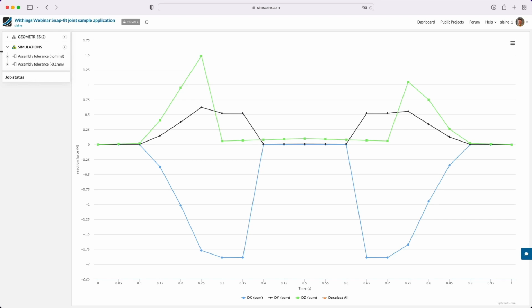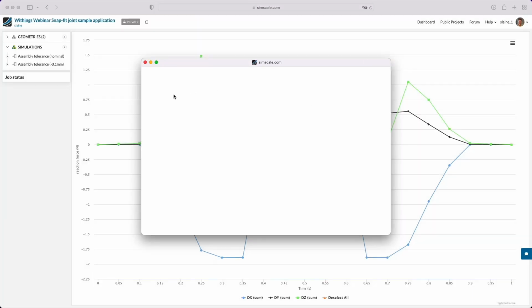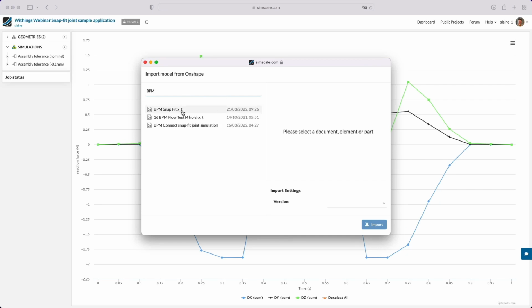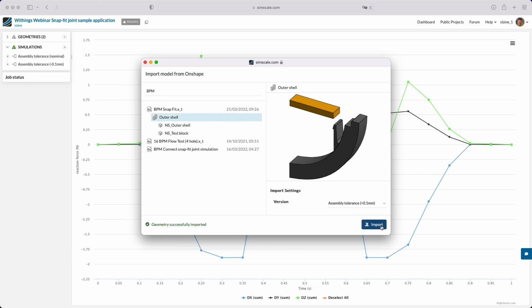So the first thing we need to do is add our geometry. And in this circumstance, we're using the geometry directly from Onshape. And we can see the various parts we've got in Onshape, and we've got variants of the model in Onshape. So from this, when it was started to be created, we've then got assembly tolerance minus 0.1 millimeters and plus 0.1 millimeters assembly tolerance. So we've reviewed the minus, and we'll have a look now at importing the plus 0.1 millimeter geometry as well.